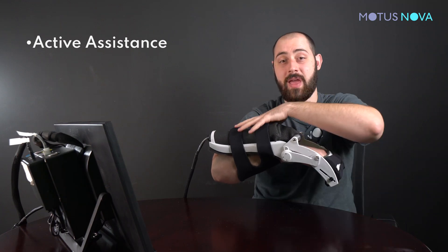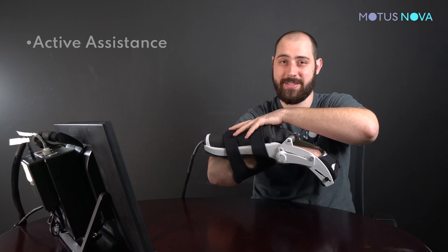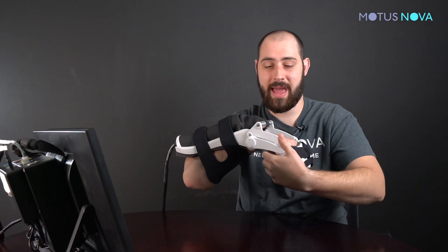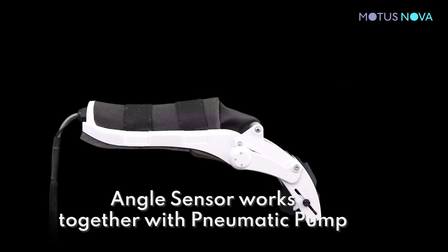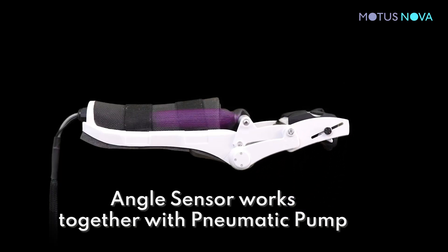The angle sensor works together with the air muscle to provide active assistance. It does this by detecting the angle of your wrist, then the muscle is inflated to provide assistance as needed to move you towards a target position.